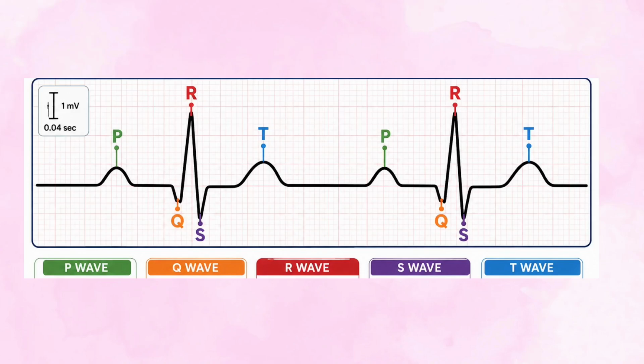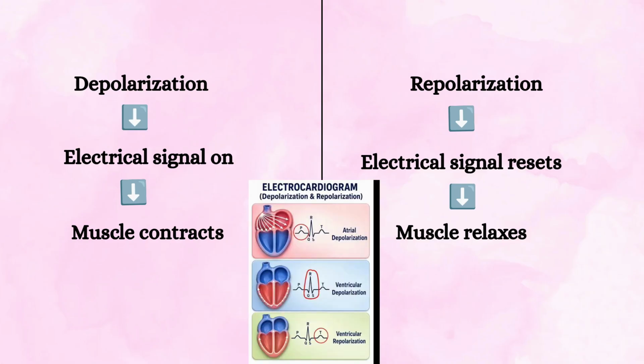Hello guys, if you don't understand the PQRST structure, ECG interpretation will be difficult. Let's build a strong foundation first. Before moving further, we should know about depolarization and repolarization.